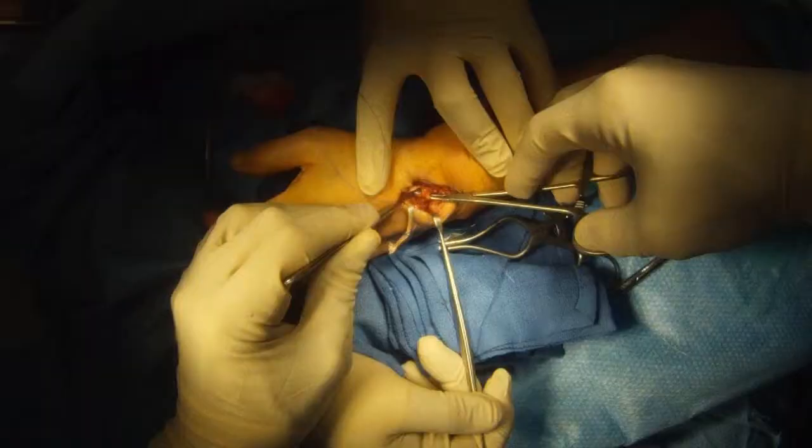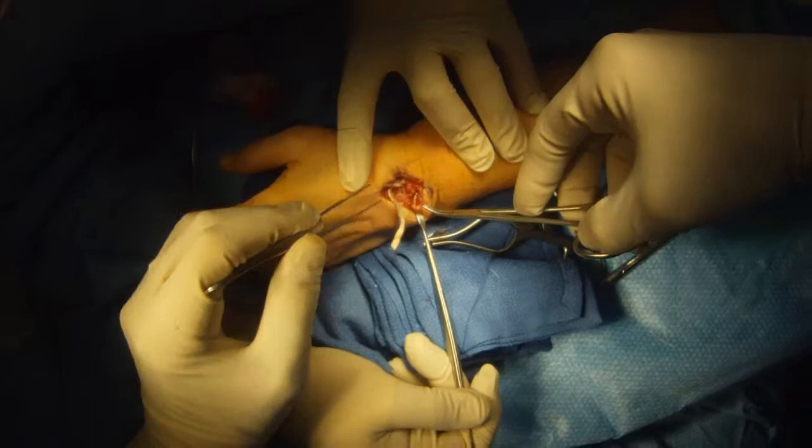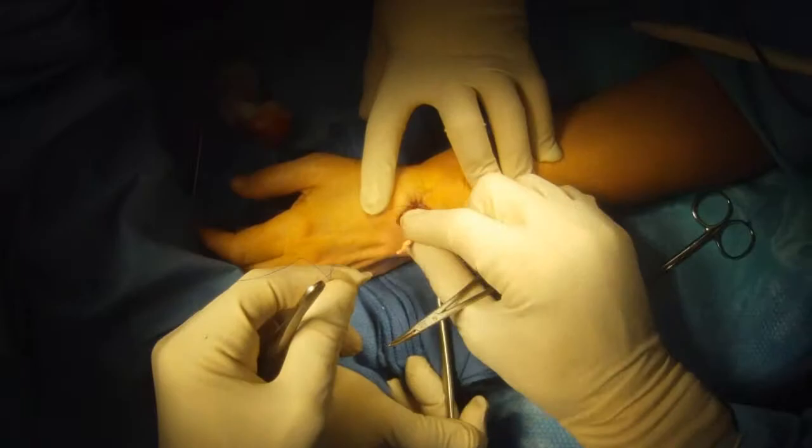Now we've dissected out another ligament in the back of the wrist. We're going to pass the tendon graft around this ligament in order to tension it and get it tight to reconstruct the scapholunate ligament.